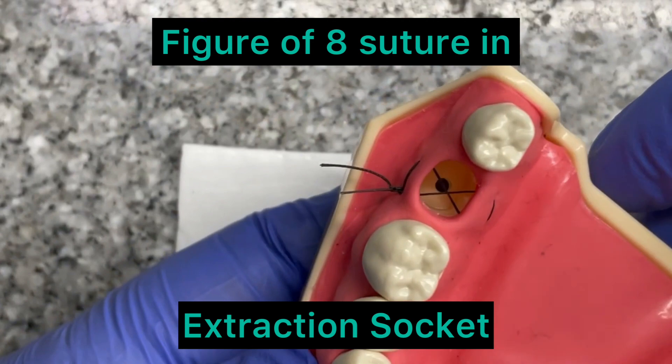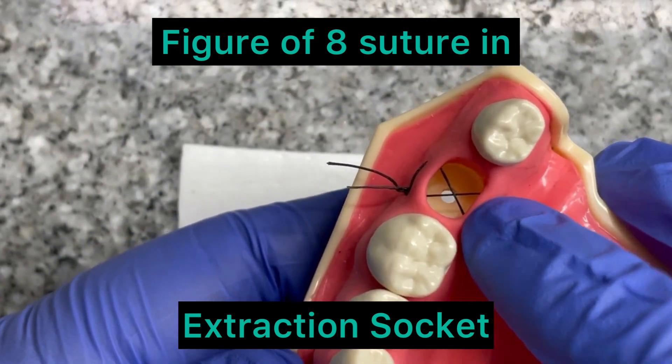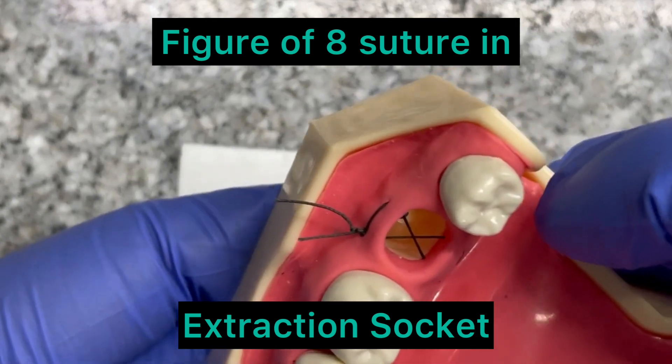This is a good figure. This is how a good figure of eight will look. This is the figure of eight that we are looking for, and this is how it will be done.